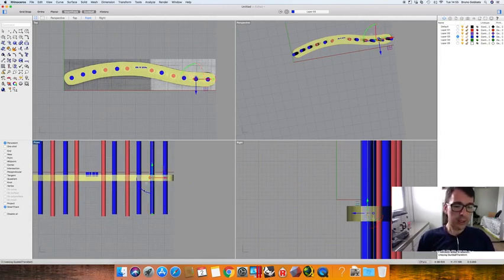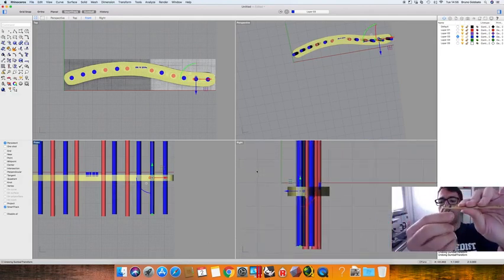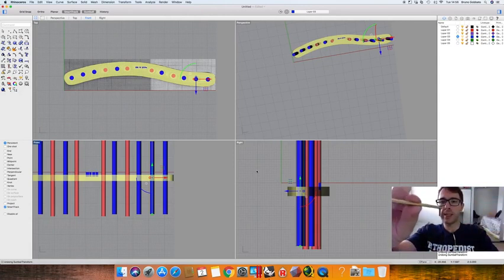And now we have a 30-degree inclination, and we can change the inclination wherever we want. So let's do this again. If the screw is tilted that way, just click minus 30, and we would have a 30-degree inclination. If the inclination is not medial or lateral, if the inclination is anterior and posterior, it works the same way.